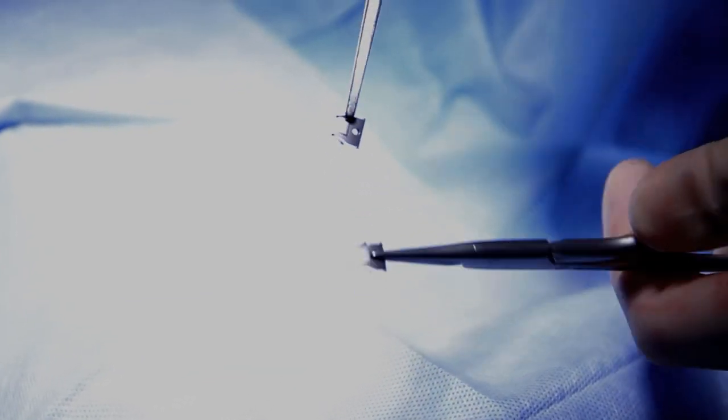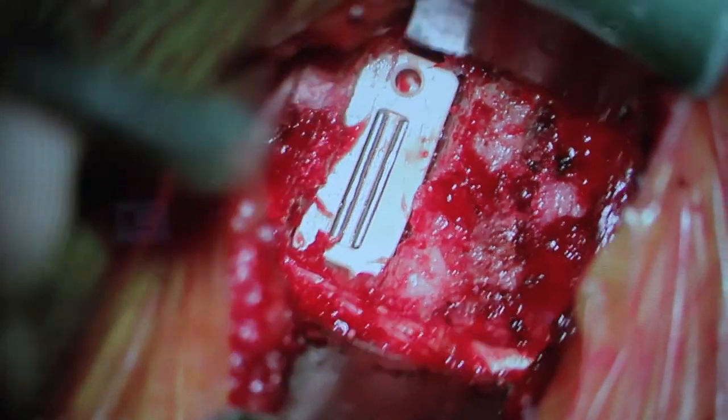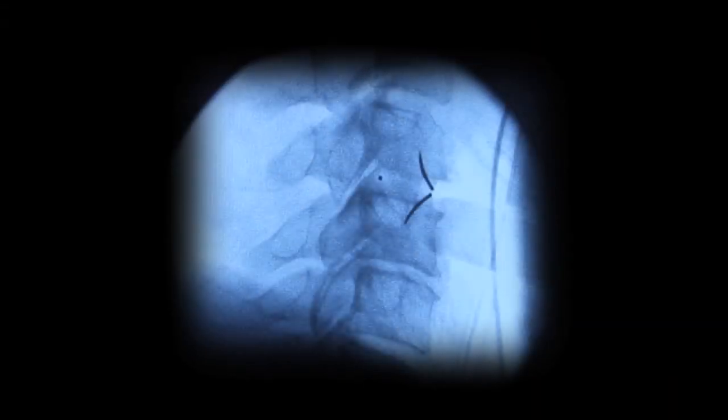A low-profile integrated plating system is used to stabilize the construct to the adjacent vertebral bodies. The inserter is removed, the area is inspected, and a final x-ray confirms proper position of the instrumentation.